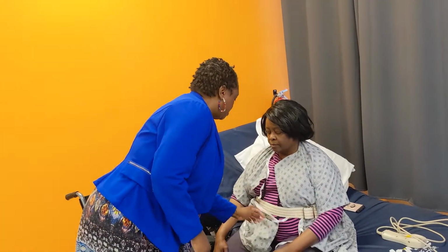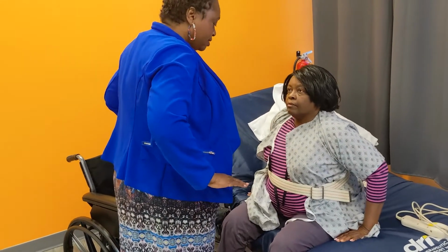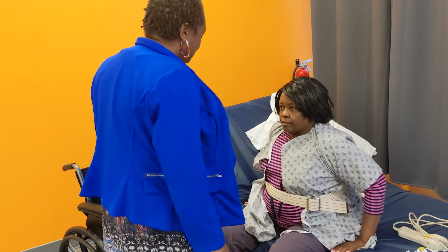And you always want to make sure patients really know what you're doing, especially with transfer. Can you put both arms, okay, on the count of 3? We're going to stand up. You're going to push your body weight up. And then you're going to take this arm. You're going to reach for this arm rest. Are you all set? Yes.